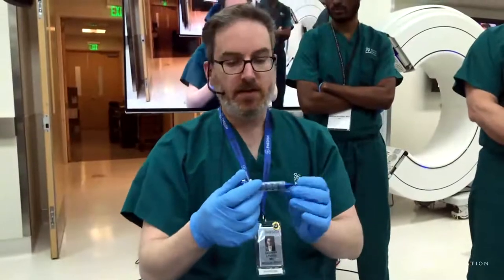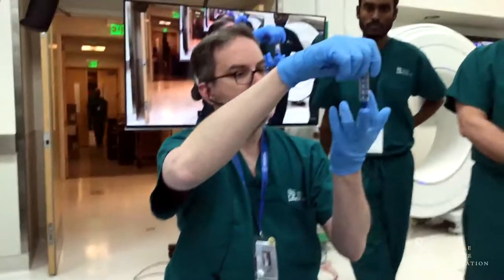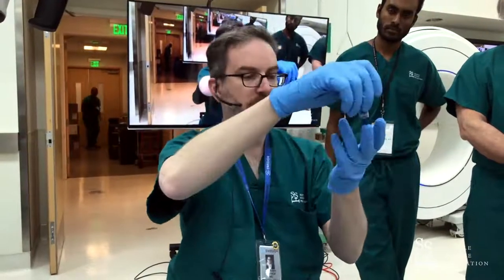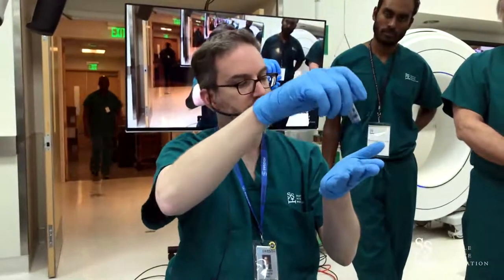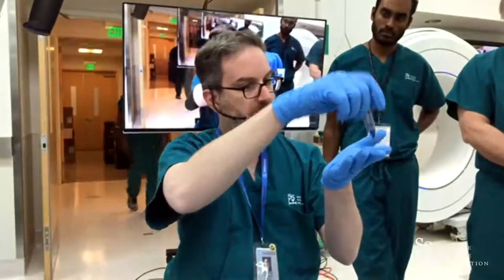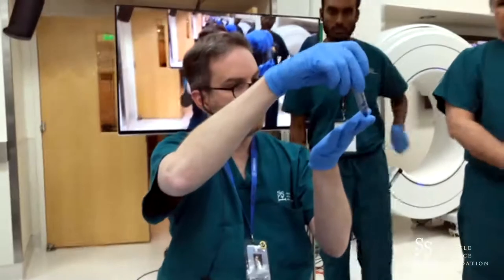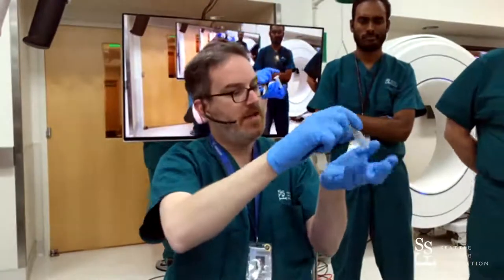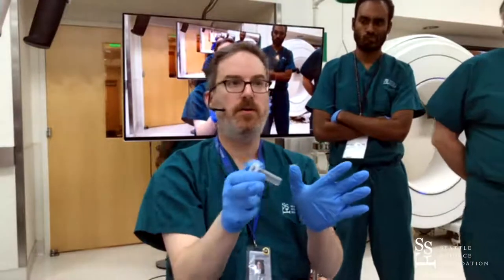The other thing is that with all these systems, you want to navigate the tip — you want to know where the tip is. If you're going into the ventricle, things are pretty straightforward. If you're trying to hit a subcortical target, there are two schools of thought. One is to come in and have the tip sitting right on your target, and then advance the port just a little bit down to there.